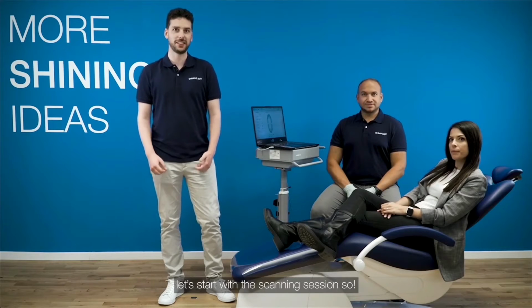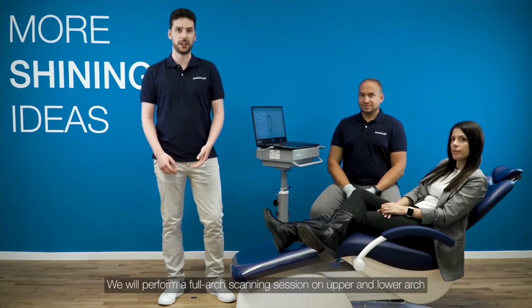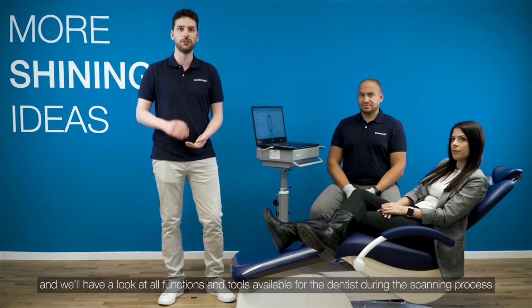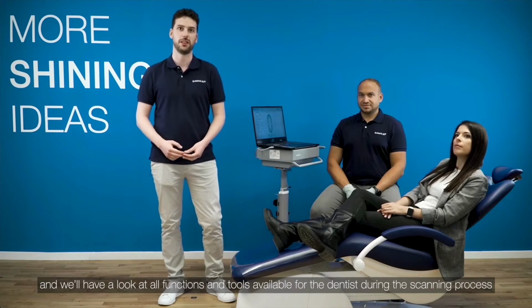Let's start with the scanning session. We will perform a full arch scanning session on upper and lower arch, and we'll have a look at all the functions and tools available for the dentist during the scanning process. Let's go!